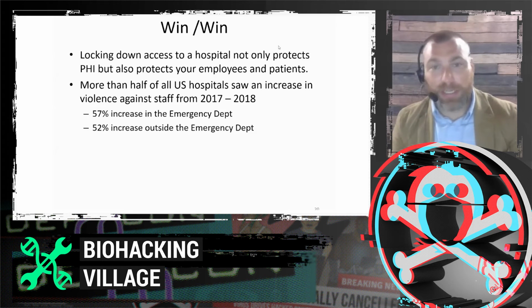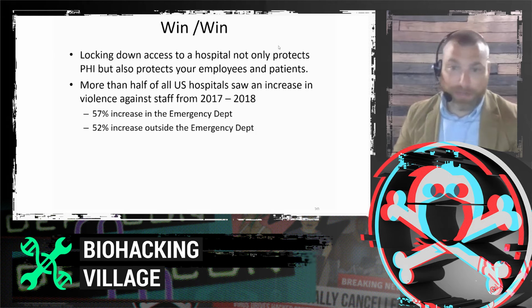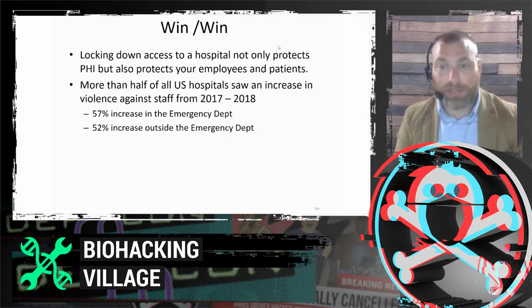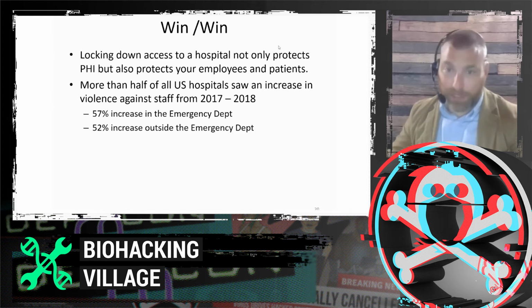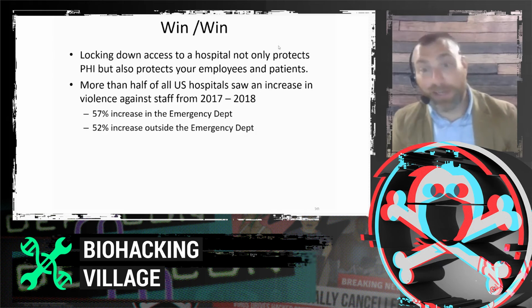Some other things, to go with the win-win philosophy: locking down access to a hospital not only protects PHI, but it also protects your employees and patients. Hospitals are places where injured people go. That's fairly obvious, but the reason they're injured or sick might just be because they're sick, or it might be because they were in some violent altercation where the assailant is now going to come back to finish the job.